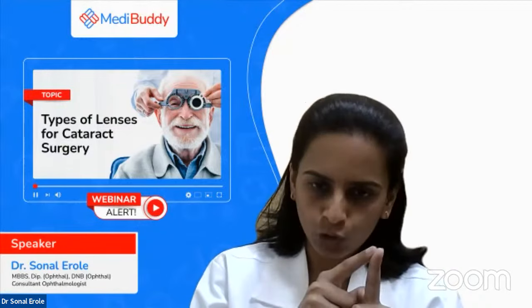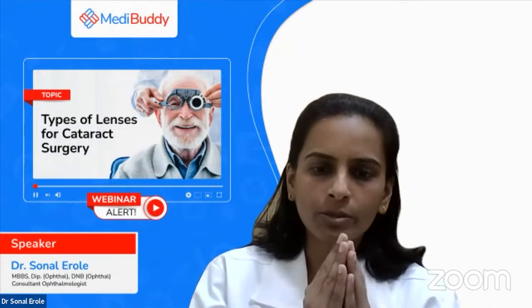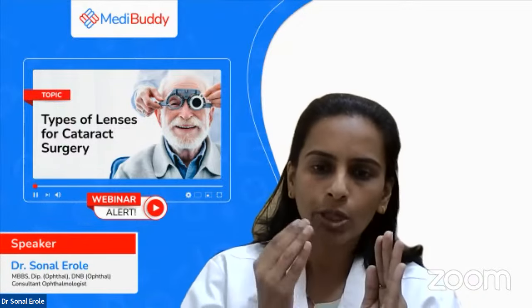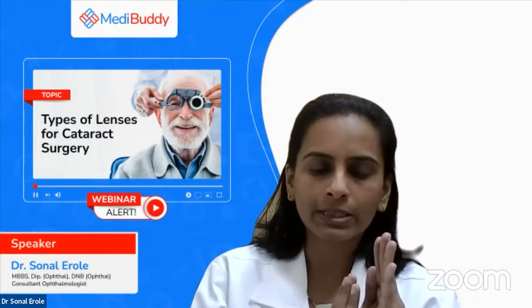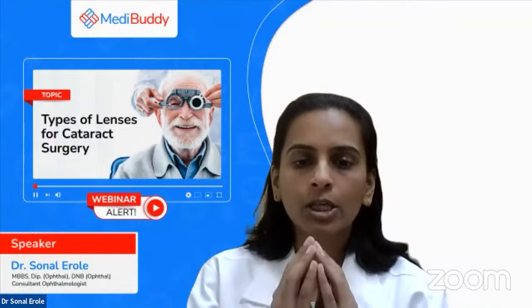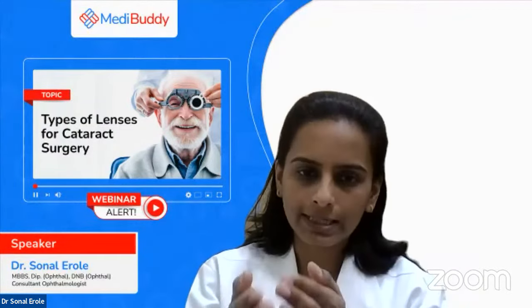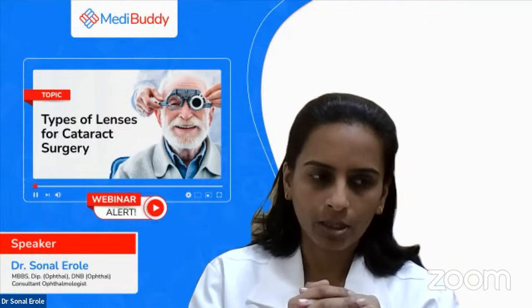The monofocal IOL is the age-old concept. It will have a single focus. Single focus means once you remove your cataract lens, you replace it with the intraocular lens. With this monofocal lens, you can see better for the distance. It will not cover your near vision or intermediate vision.